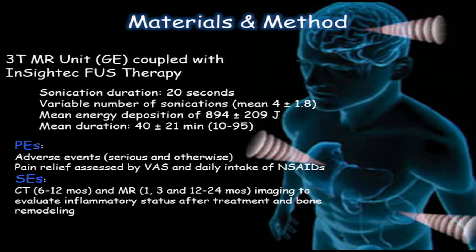And this imaging can evaluate the inflammatory response and the edema. And this is very important because, again, one of the main factors in osteoid is the inflammatory response that causes this increased pain that we are talking about all this time.